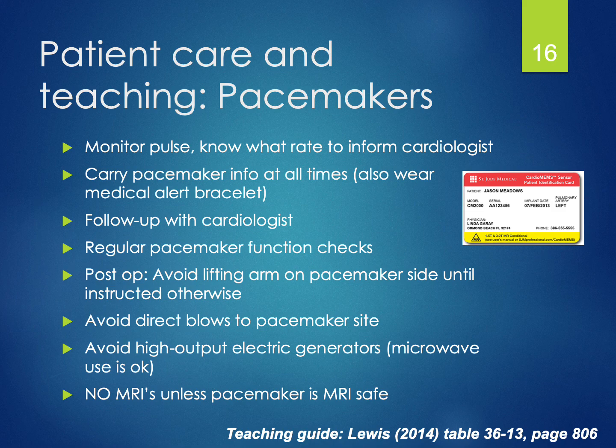Now, immediately post-op, when a permanent pacemaker is placed, these patients should go through the basic post-op guidelines, such as monitoring the incision for bleeding and signs of infection, but also they should avoid lifting the arm on the operative side to avoid dislodging those newly implanted leads. And the cardiologist will want to determine when the patient can actually resume normal range of motion again.